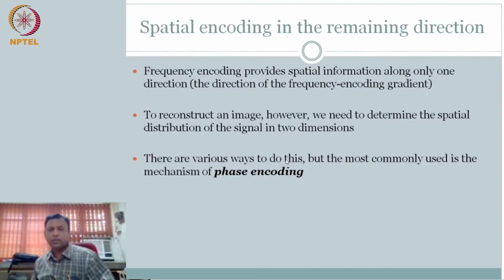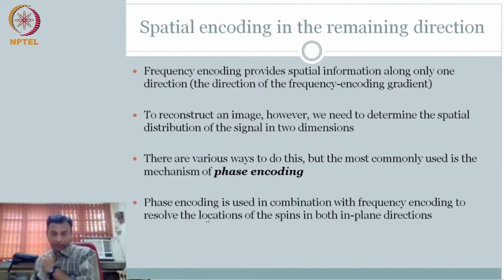There are several ways to do it. One popular way is using what is called phase encoding, frequency and phase. If you have trained your line of thinking for MR using the 2 other encoding schemes and the other concepts that we have looked at, this is straightforward. Essentially what we are saying is, if you can combine this phase encoding with the frequency encoding that we already have, then we should be able to tell x comma y contribution, right?